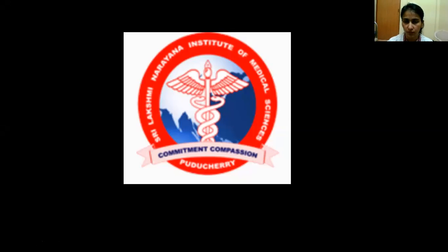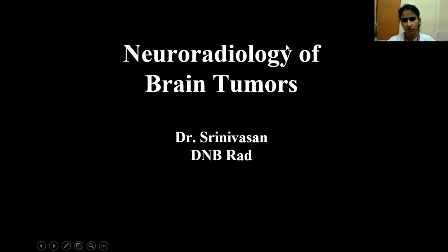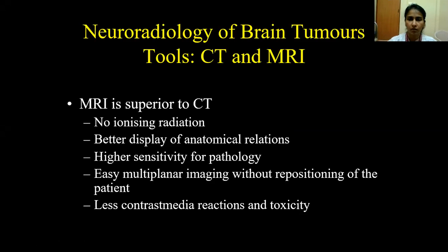Hello everyone, today's topic is neuroradiology of brain tumors. We are going to study it with tools like CT and MRI. And MRI is considered superior to computed tomography for the reasons mentioned below.